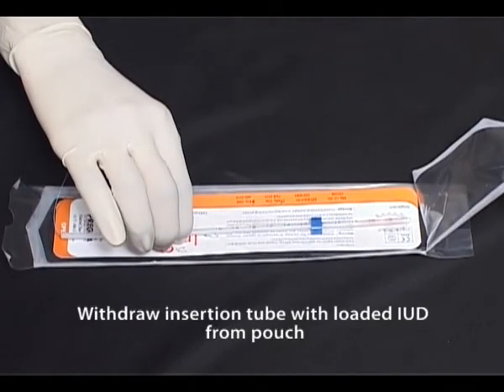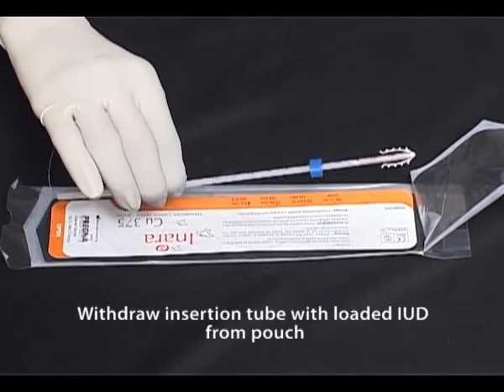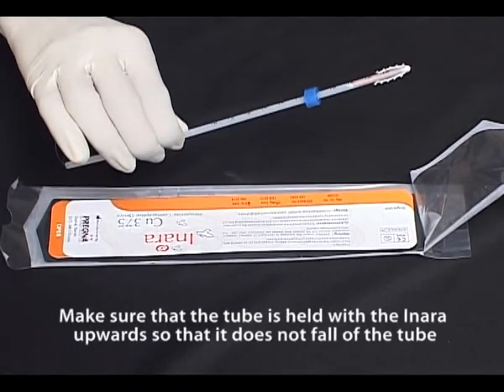Withdraw the insertion tube with loaded IUD from the pouch. Make sure that the tube is held with the inara upwards so that it does not fall off the tube.